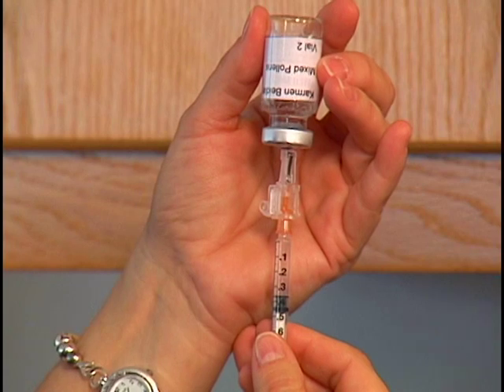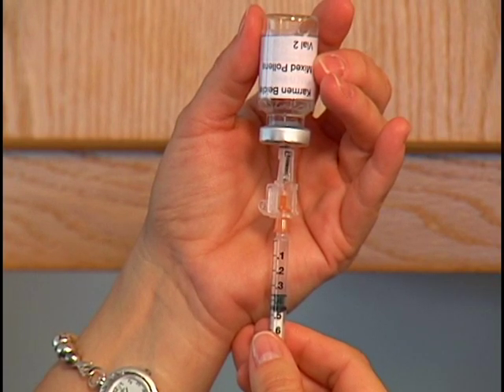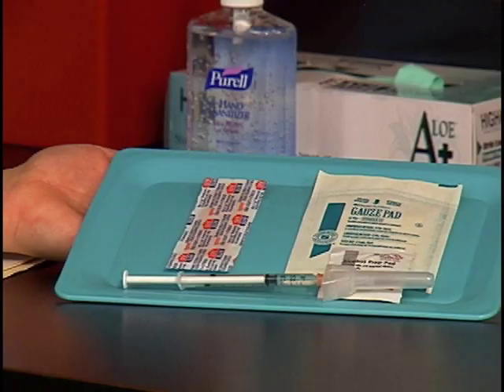The patient must receive 0.35 cc's of her mixed pollens allergy medication today. Draw up the medication and place the needle and syringe on a tray along with an antiseptic wipe, a gauze pad, and an adhesive bandage. Greet the patient and introduce yourself.